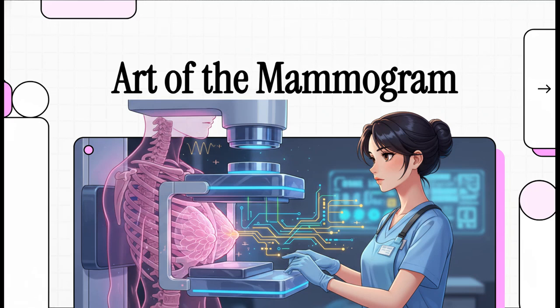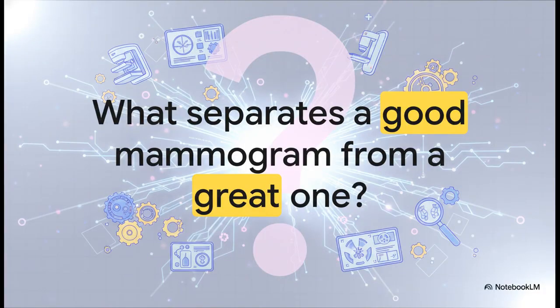Hey everyone and welcome. Today, we're going to pull back the curtain on a procedure that, let's be honest, many of us are familiar with, but very few know the incredible details behind. We're going to explore the hidden art and the science of what it takes to get a technically perfect mammogram. Really, it all boils down to this one question.